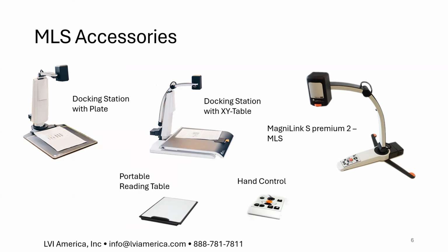This is a really good picture because you can see behind where the S is just kind of docked right into that. And you can see that it's real simple. You just lift up and pull it out, and now you're ready to go. So that docking station would stay in whatever environment that you're using it in, but you don't need to carry it around. So now you've got still the small little 4.2-pound camera.